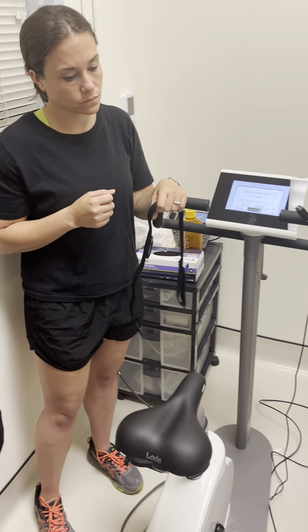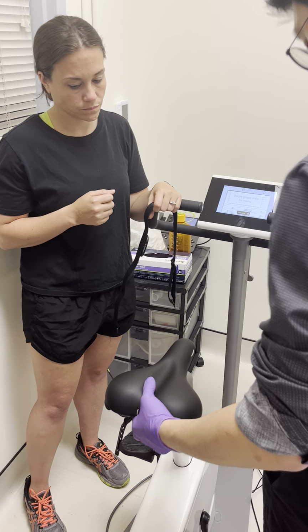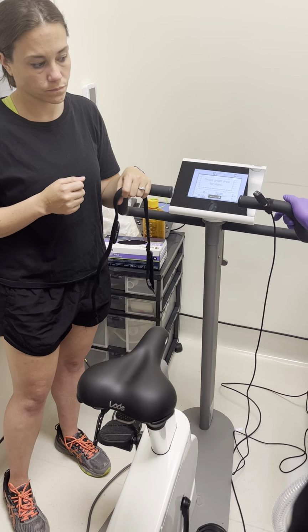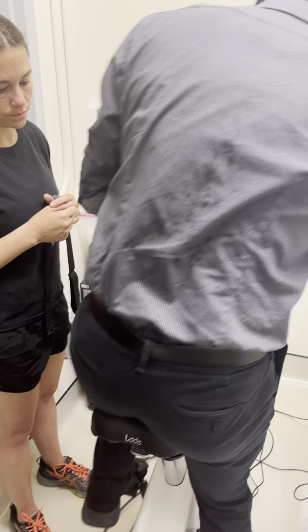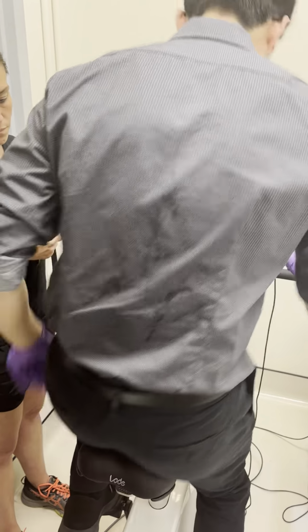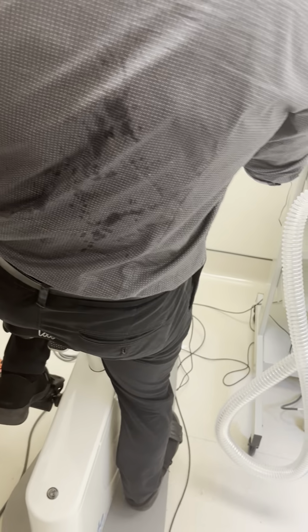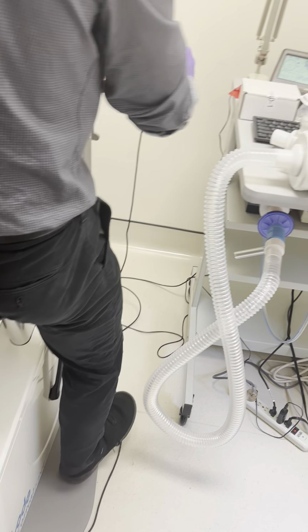Okay. So when you do the seat height, it's very simple. You might want to actually have the person get on the bike first. So have them get on the bike and then just raise themselves up and then change the height. And I think what's dictated in the protocol is there has to be a slight bend at the knee at the bottom.